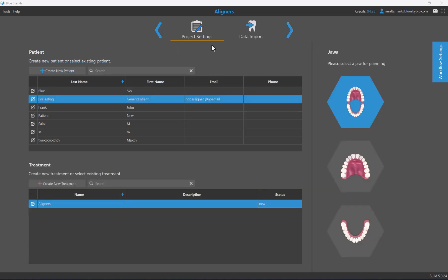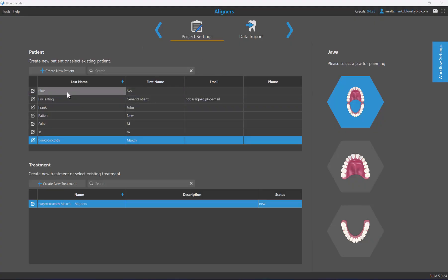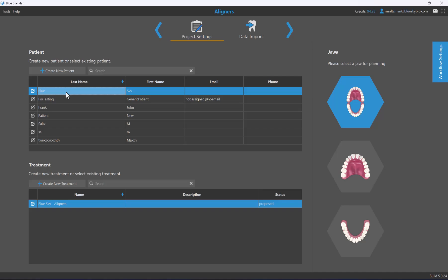If you're just loading a case to try out features and functionality, or you don't want to organize cases by patient, there's a hard-coded patient labeled 'for testing generic patient.' You could associate your cases — or even all your cases — with this generic patient, though it's not recommended.